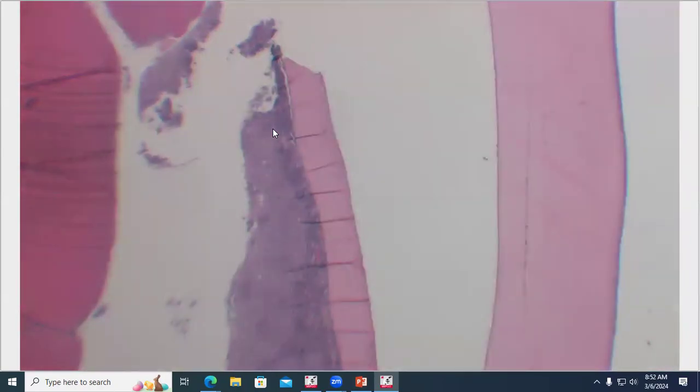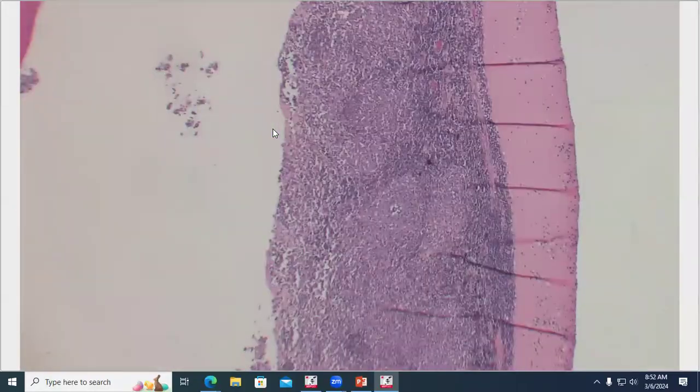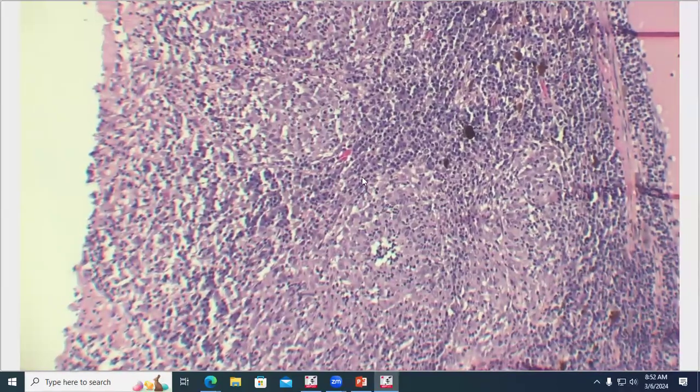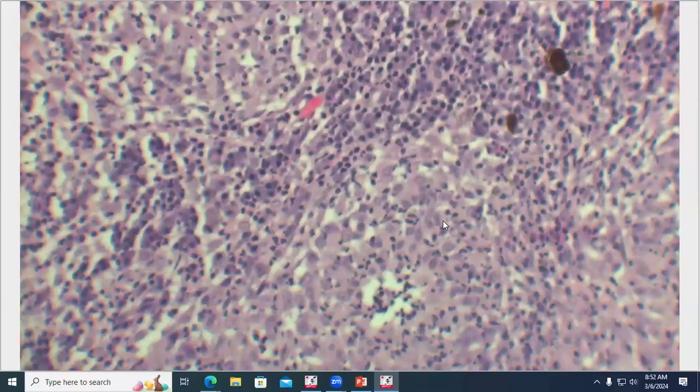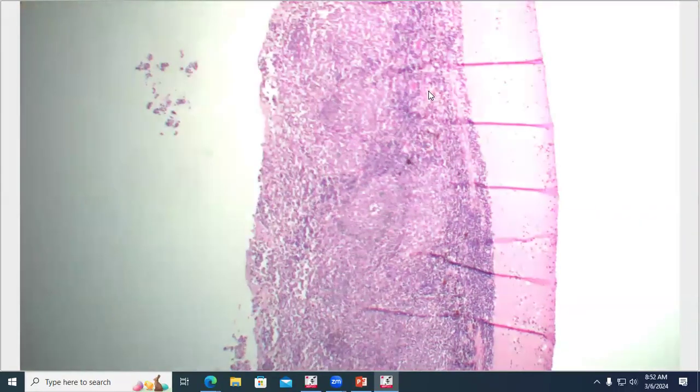Yes, we have the cornea on our right side again, so we flipped it again. And let's just start by zooming in right here at that anteriorly positioned iris, and we see that it is very, very distorted by coalescing pyogranulomas. We have these cores of neutrophils surrounded by multiple layers of epithelioid macrophages. So there you go. In particular, right here, a very nice example of a pyogranuloma. And then lots of lymphocytes and plasma cells between those as well. So pyogranulomatous and lymphoplasmacytic uveitis again, rather more severe this time.